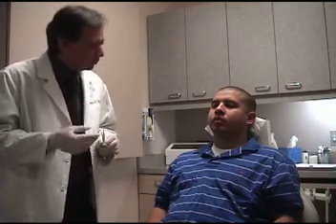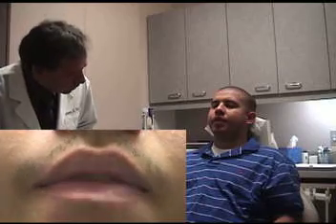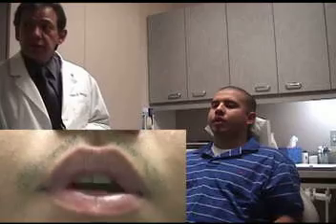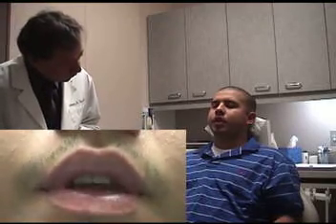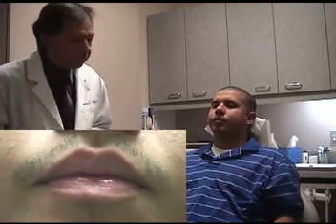All right. Now we're going to ask you to count, please, and we'd like you to count from 66 to 77, if you would. 66, 67, 68, 69, 70, 71, 72, 73, 74, 75, 76, 77. Okay.